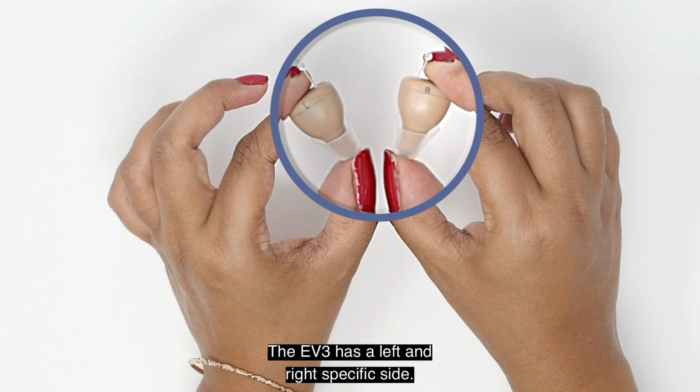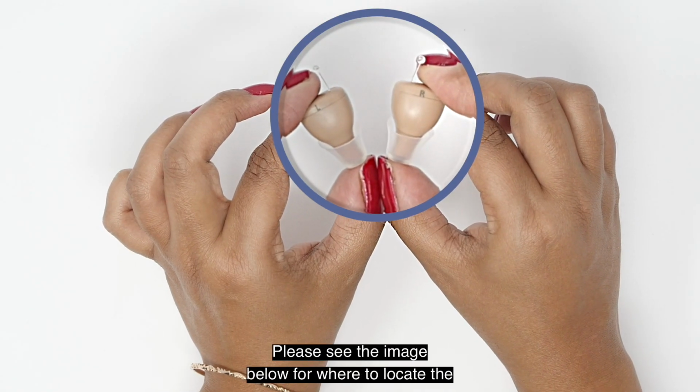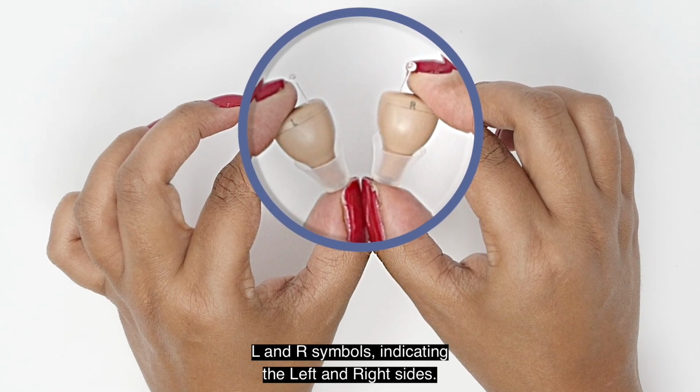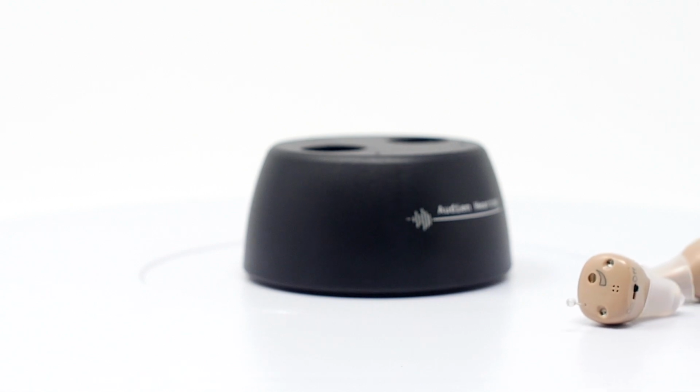The EV3 has a left and right specific side. Please see the image below for where to locate the L and R symbols, indicating the left and right sides.